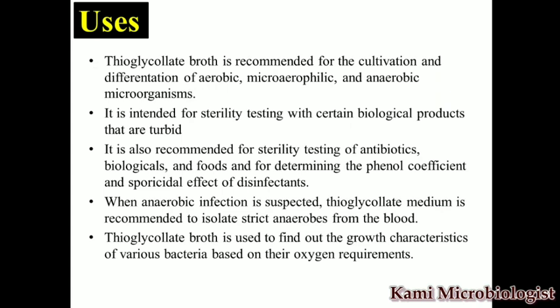Then we have the uses of the thioglycollate broth. This type of media is specially recommended for the cultivation and differentiation of aerobic, microaerophilic, and anaerobic microorganisms. This type of media is also important for sterility testing of certain biological products that are turbid. We also use it to check the sterility of antibiotics, biological and food materials, to determine the phenol coefficient, and the sporicidal effect of disinfectants.